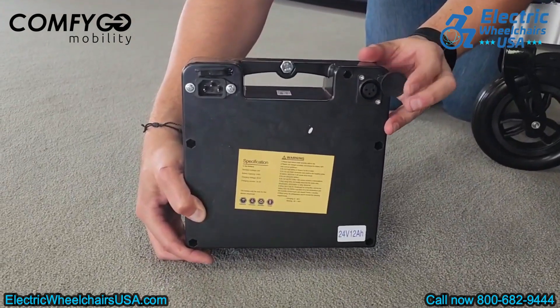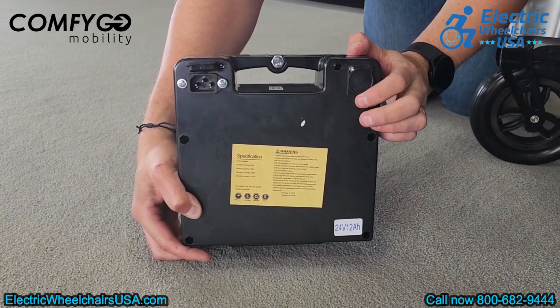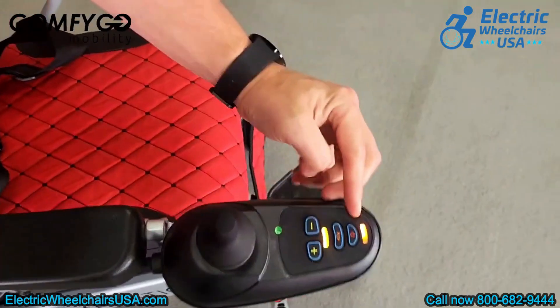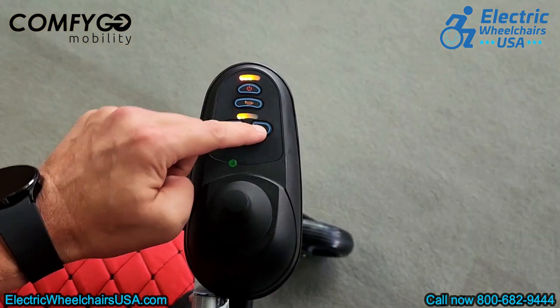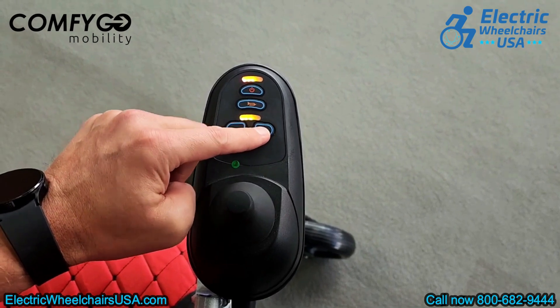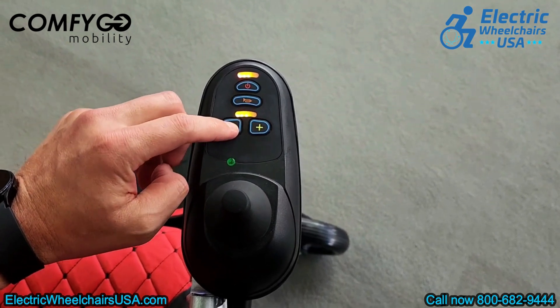The battery pack has a convenient handle, and since it's airline approved, you can easily carry it as a personal item on flights. The joystick is very user-friendly. It includes a battery indicator, an on-off button, a horn, and plus-minus buttons to adjust the top speed, which can reach 4 miles per hour.